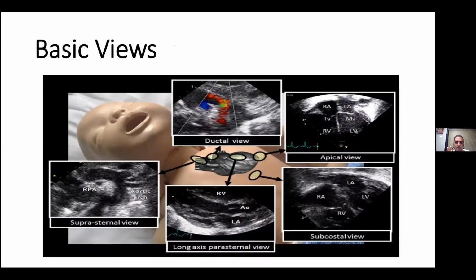The thing is, why have they given the windows on the baby's or patient's chest? They have given this area to view the different parts of the heart, what you have just seen in the heart anatomy. So this is to see the relevant areas of the heart in various sections. This is just a crude guideline, just a crude area they have given, so that you can fine tune and adjust to get the proper image.